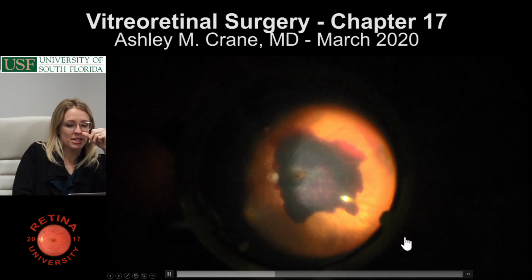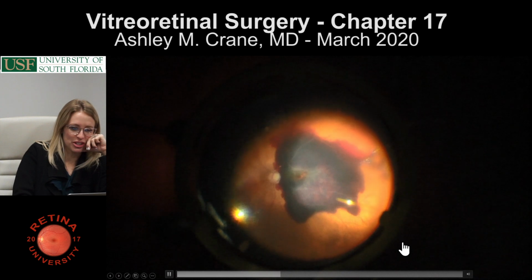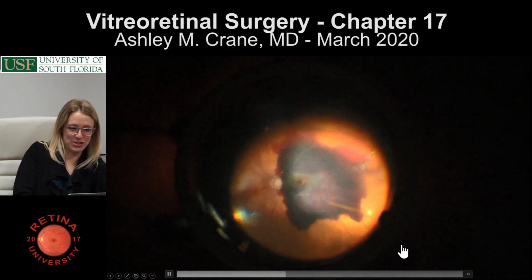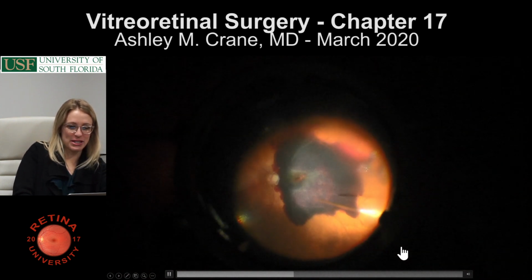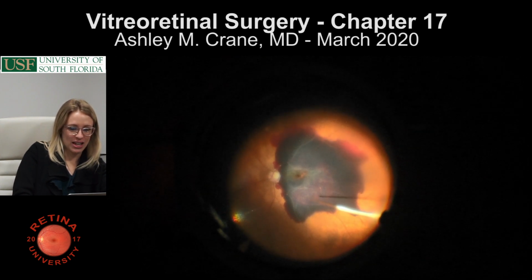Right. This was only a few years ago, so you can see I'm extremely gingerly approaching the retina because this is probably a very stressful situation for me. It wouldn't be so bad anymore, but that's the first time I'd ever done it.